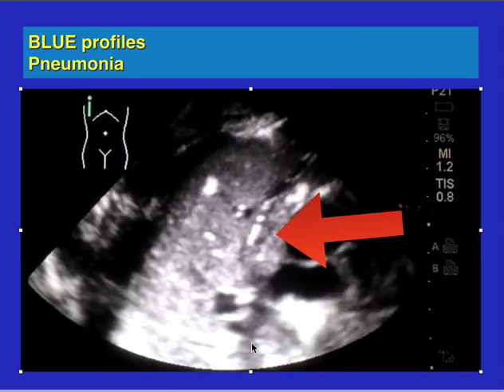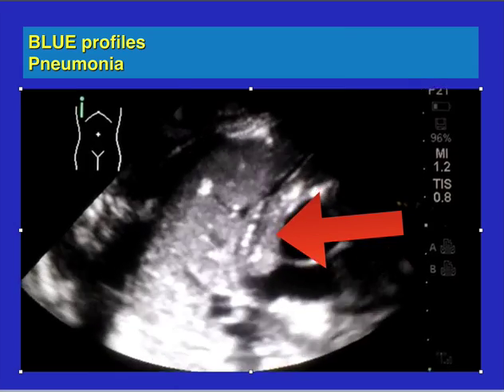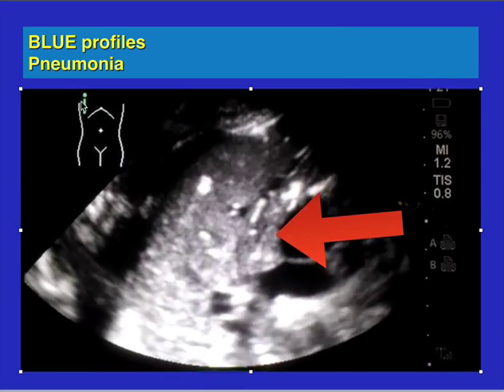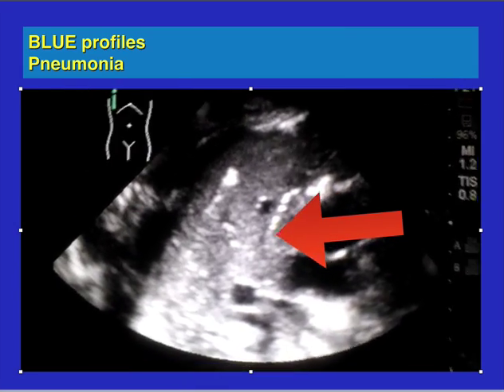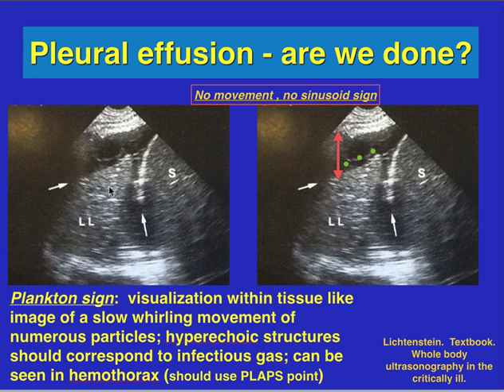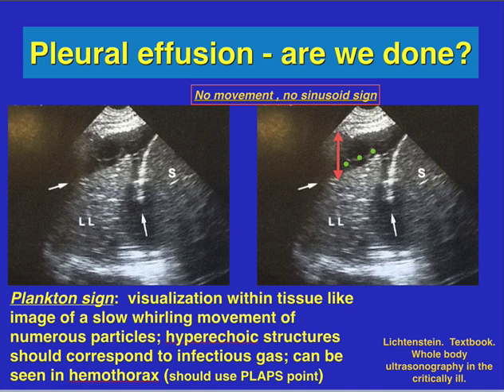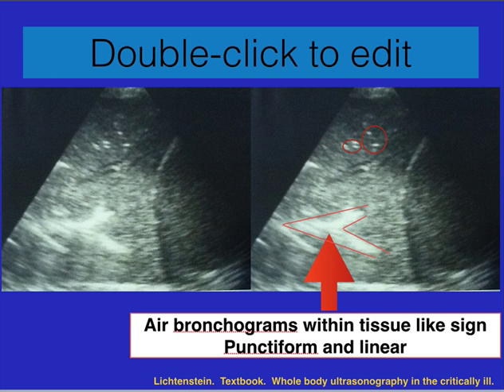You can see air bronchograms with the air moving inside — this is actually in the right upper chest, this is actually the lung. You can also see the plankton sign, which is visualization within the tissue-like image of slow whirling movements. For instance, right here you see the left lung, and in this area you may see slow whirling movements that indicate hyperechoic structures and could correspond to gas.